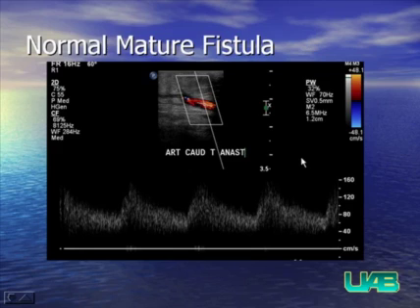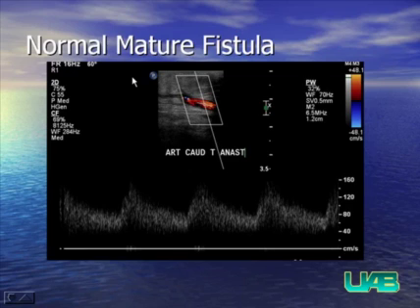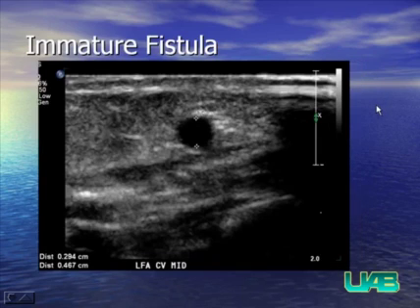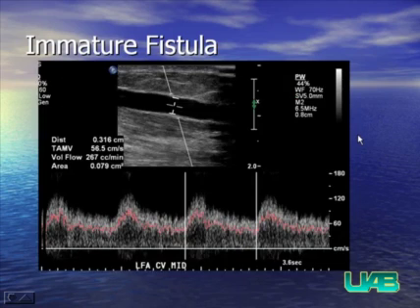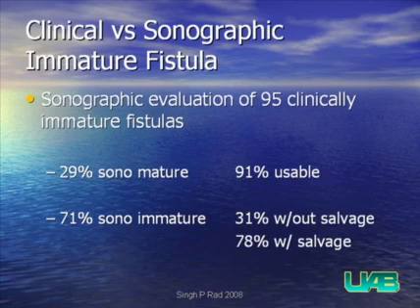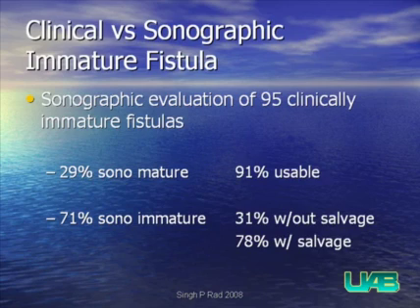We always examine the artery distal to the anastomosis to see whether there is still flow going to the hand. In this case, even though we are below the anastomotic site, flow is coming toward the transducer — toward the patient's head — showing reversal of distal arterial flow. Comparing this to an immature fistula: the diameter is 2.9 millimeters, below the 4-millimeter cutoff, and the volumetric flow is only 267 milliliters per minute. This raises the question of how sonographic maturity correlates to actual clinical fistula access.